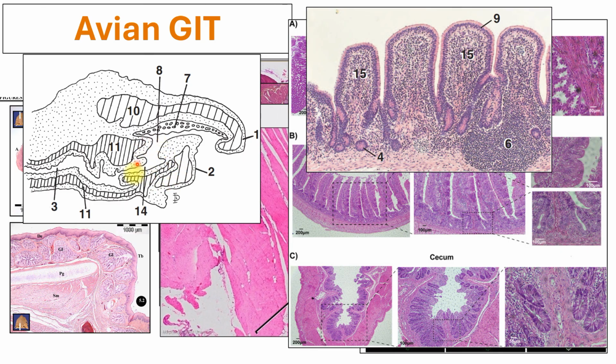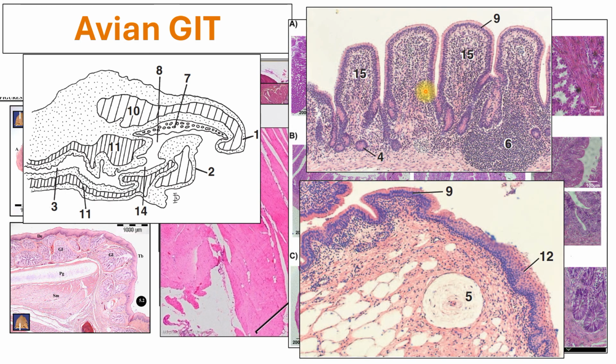So the innermost lining of your cloaca is still lined by simple columnar epithelium, while the outermost area, again, if it is more exposed to outside components, it would need the stratified squamous epithelium. So here you can see the junction between the outer areas of the proctodeum and the inner areas which contain your simple columnar epithelium.